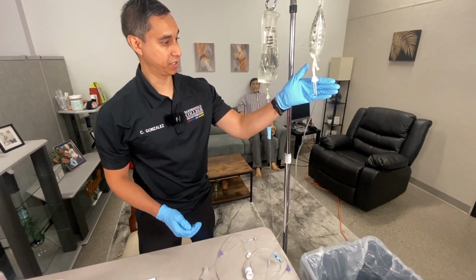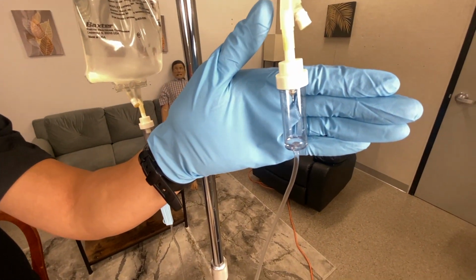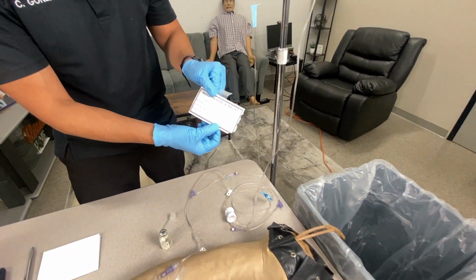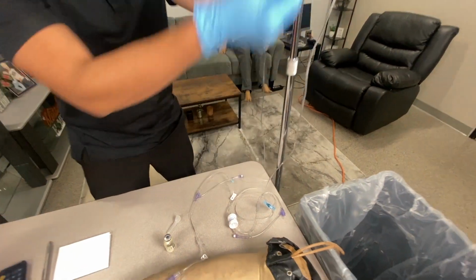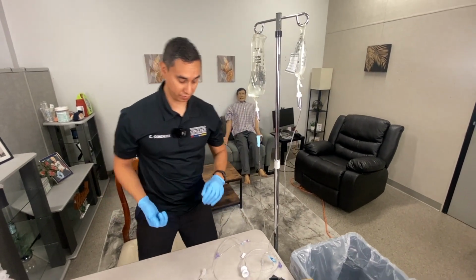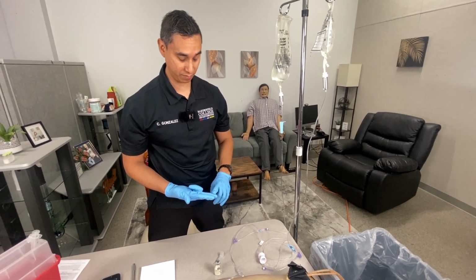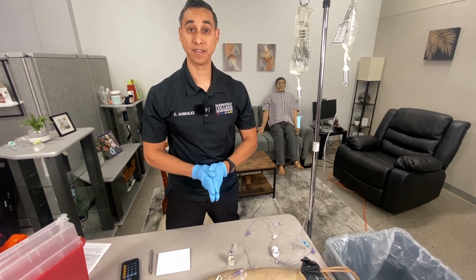We're going to check, make sure that it is dripping, which it is. We're going to add a medication sticker, John Doe, 225 at 934, and my initials. Attach it to your medications. And now at this time, we're going to recheck the vitals. We are going to assess for any adverse reactions and make sure that our medication is working. Thank you. That is the scenario.